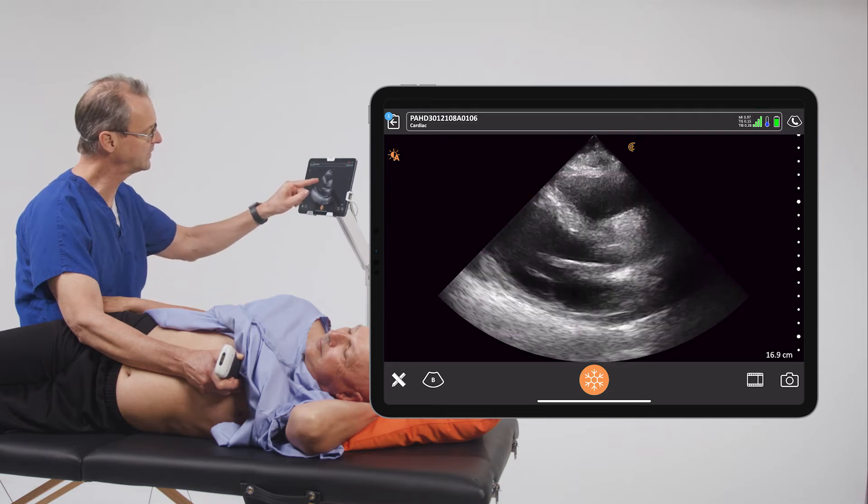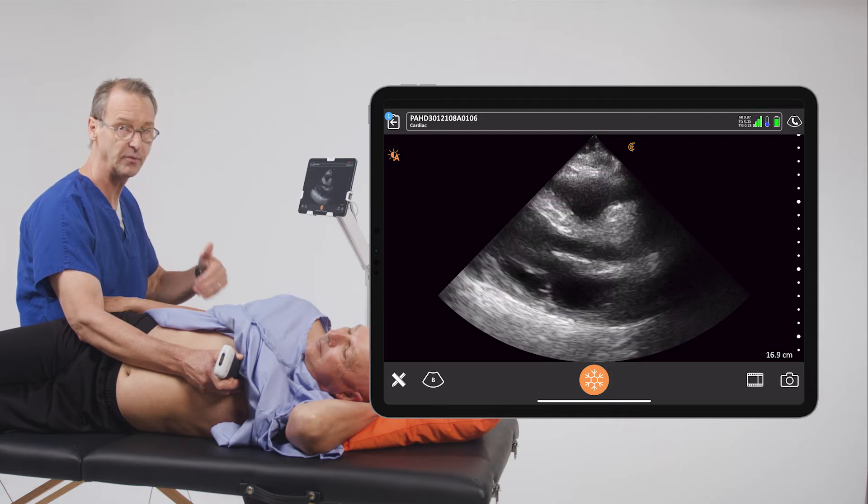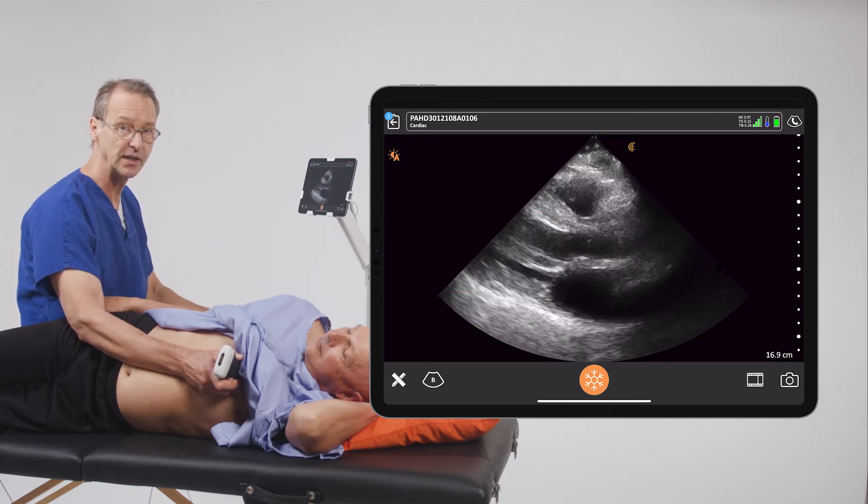And finally, we can just look at the heart muscle itself — the interventricular septum as well as this portion of the heart. We can see that every time the patient goes through systole, the muscle gets shorter and it gets thicker.